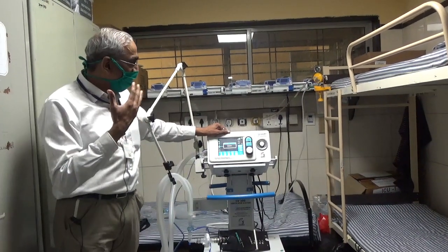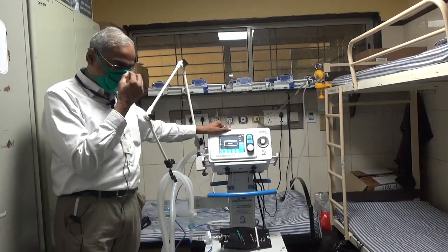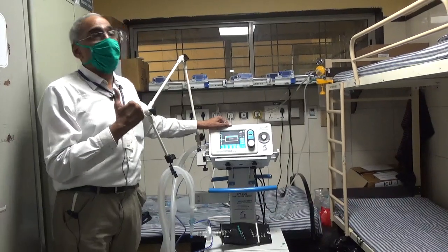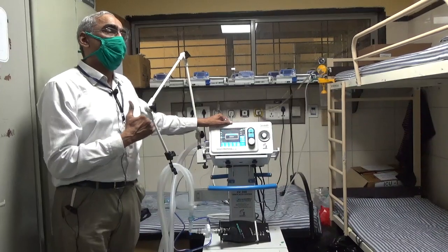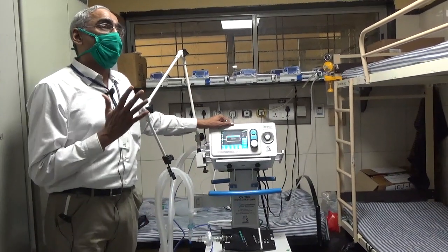Then of course, you need to make an FiO2 setting, and the FiO2 setting, when you start off, may be kept on the higher side. Whatever FiO2 setting you had previous to this on the HFNC, that same FiO2 setting can be used. So usually, we will choose around 60%, 60 to 100%.